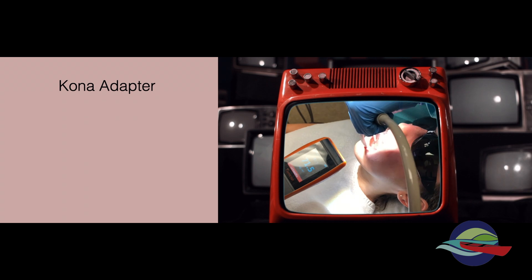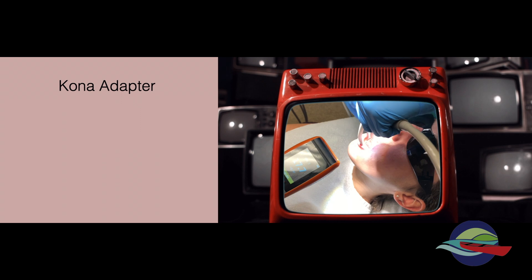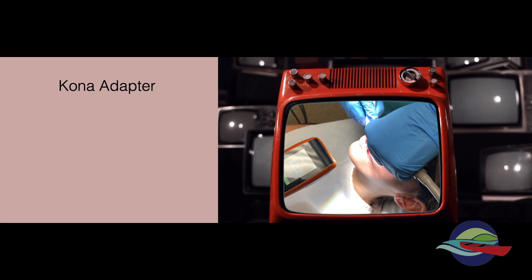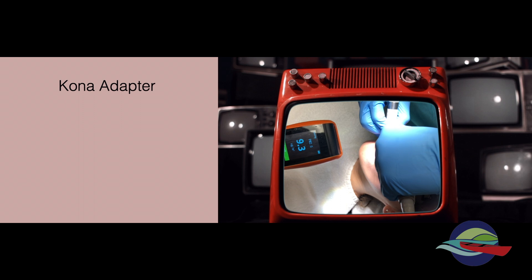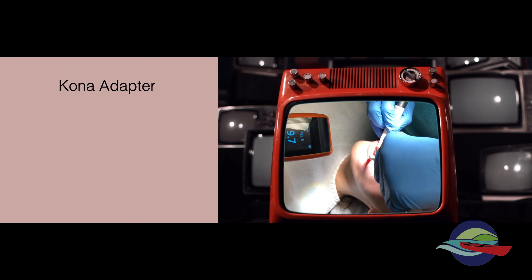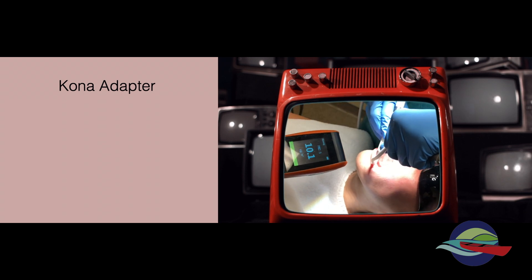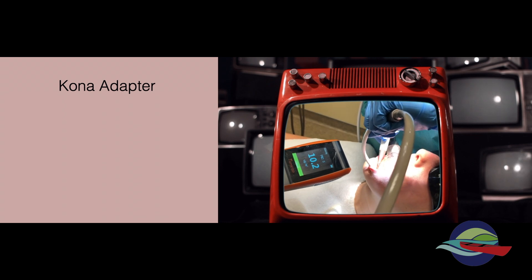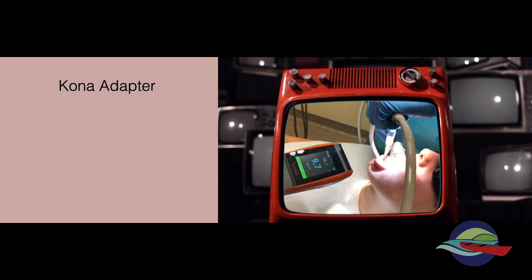I should mention that this was also the first time Colleen, our hygienist, was using any of the suction systems that we're showing today. Once the suction had been on for a while, the numbers were reduced to safe levels. It was more effective in the posterior area than the anterior, as it would be with all devices.